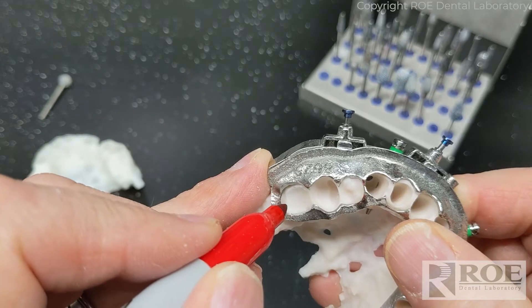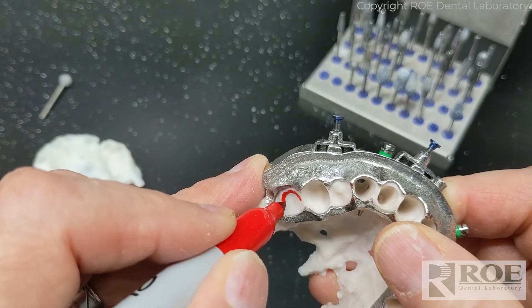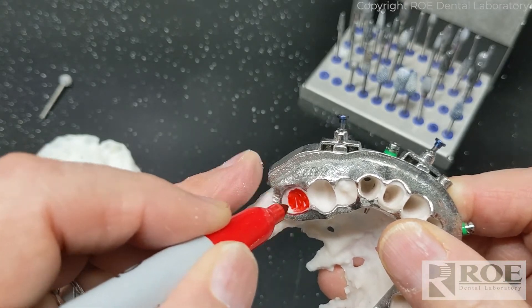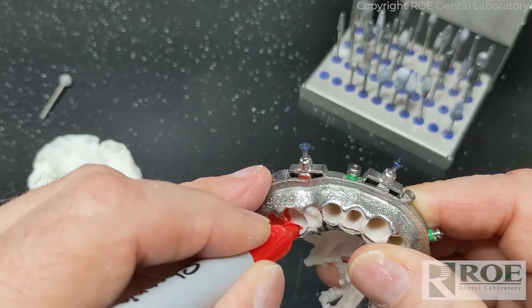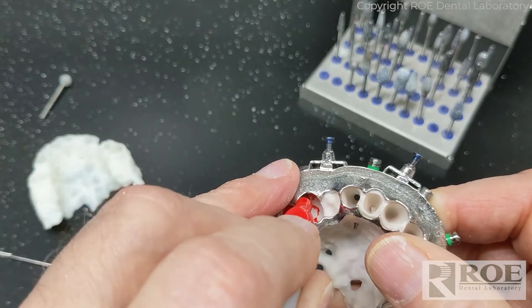I'm going to mark the areas that we relieved on the bone model so that you'll know where we actually did work. Most of the time you're going to see that area follows the footprint of the prosthetic tooth that we're replacing in the bone.